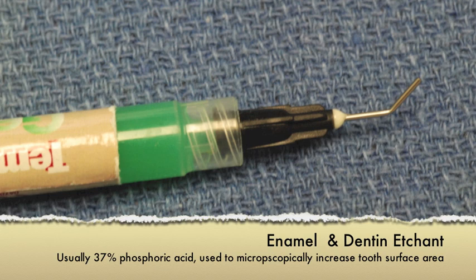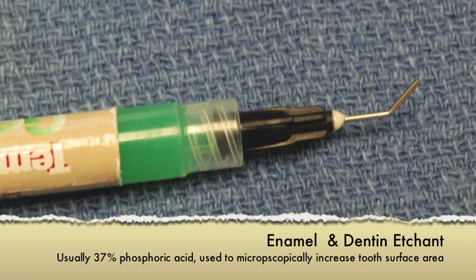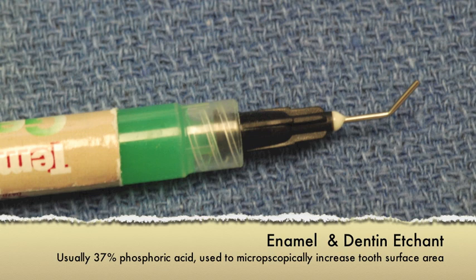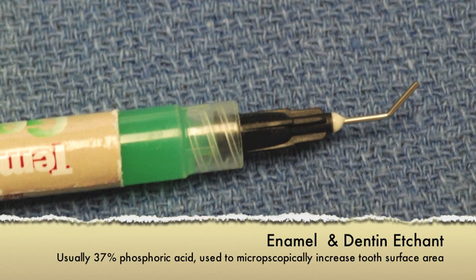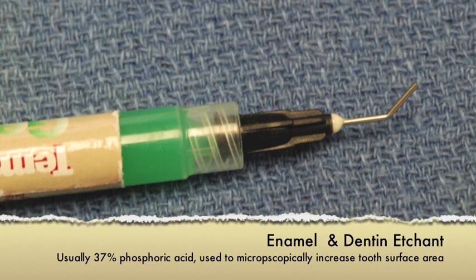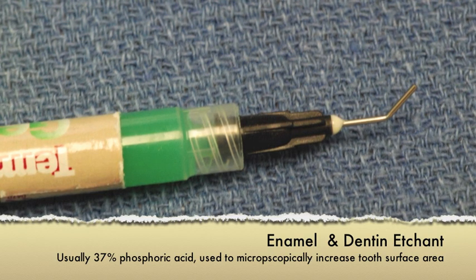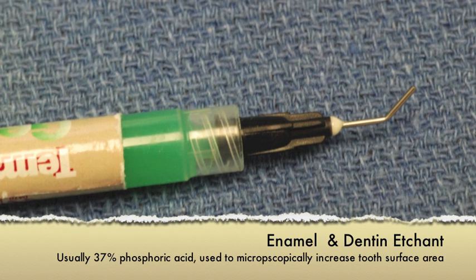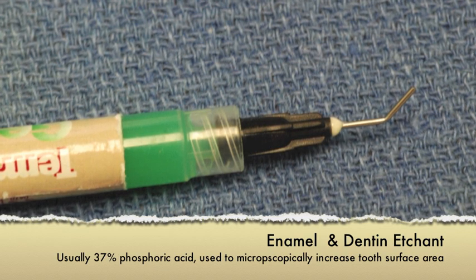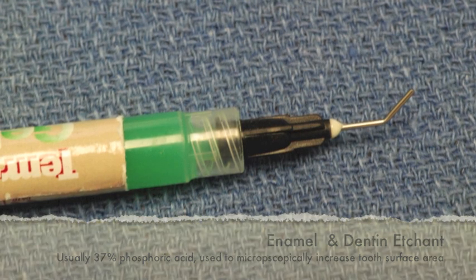This roughened surface, in conjunction with a liquid acrylic resin that works its way into the nooks and crannies of the etched surface, is then cured to form a solid-to-solid interface that aids tremendously in the retention of the restoration. The use of this material is vital to the long-term success of modern composite restorations.